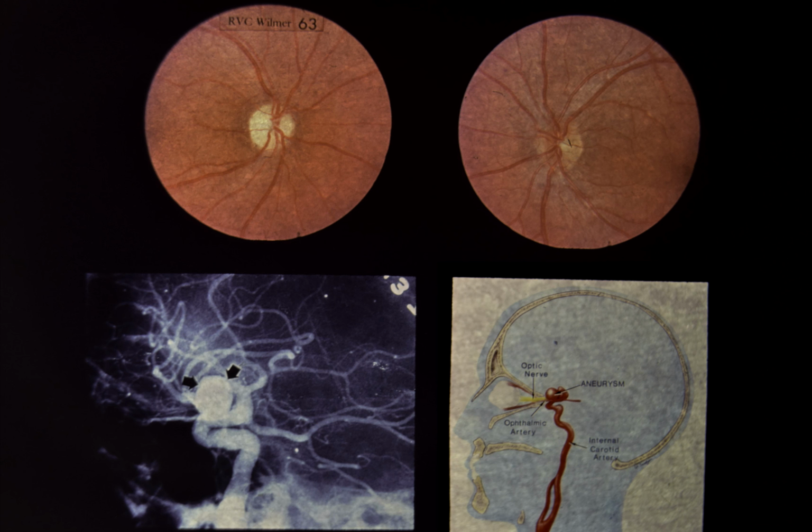Upper left, the right optic disc is pale, and there are defects in the peripapillary retinal nerve fiber layer. Upper right, the left optic disc and peripapillary retina are normal. The history of slowly progressive, unilateral visual loss with optic atrophy suggested a mass lesion compressing the right optic nerve. Skull X-rays and optic canal polytomograms were normal. Lower left, a cerebral angiogram demonstrates a large aneurysm arising from the right internal carotid artery at the origin of the ophthalmic artery. Lower right, the artist's sketch of the ophthalmic artery aneurysm shows how it may compress the optic nerve and cause optic atrophy.